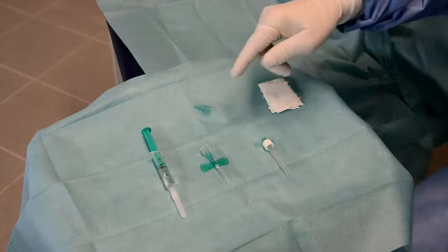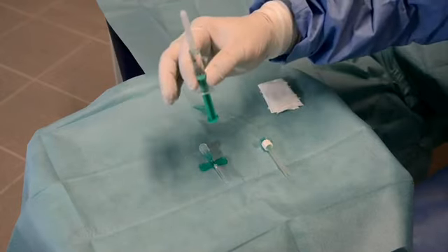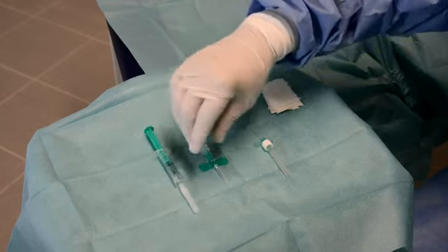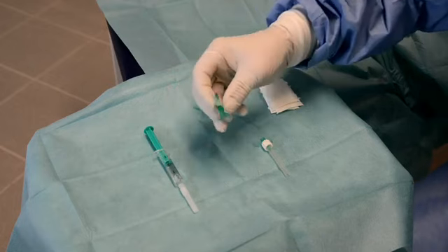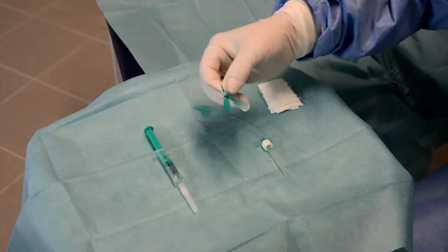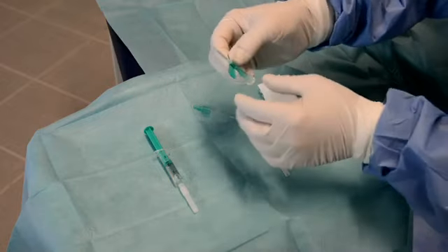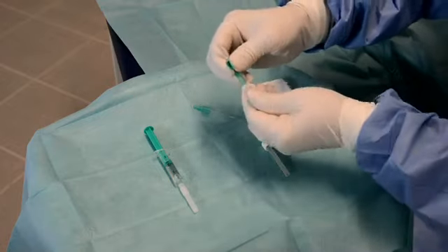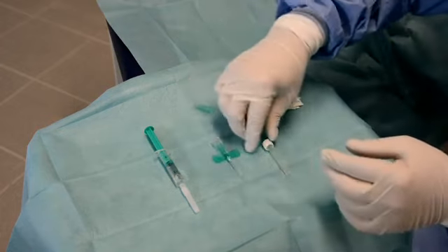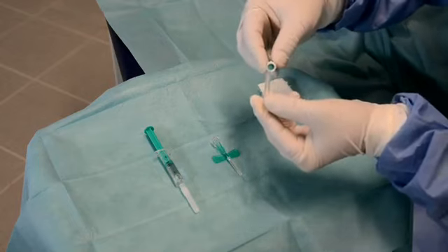You see in the syringe we have the local anesthesia. Normally we use Candicaine, which we give locally in the area. If the pathology is more superficial, so on the shoulder, normally from ventral not more than 2 or 3 centimeters, we can use a smaller cannula, in this case a butterfly with a needle about 2 centimeters long, which has a cap at the end that we can remove later for insertion of the sterile catheter.